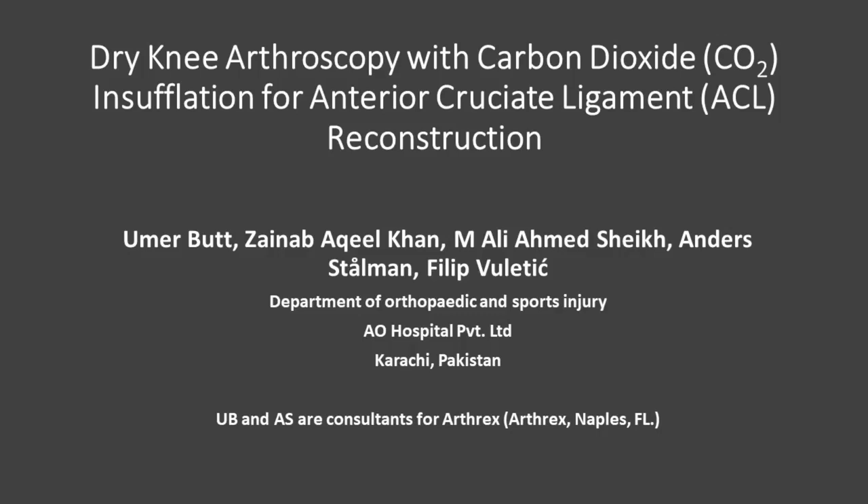This video explains our dry knee arthroscopy technique using intermittent carbon dioxide gas insufflation for anterior cruciate ligament reconstruction. The authors and contributors have no conflicts of interest to disclose.